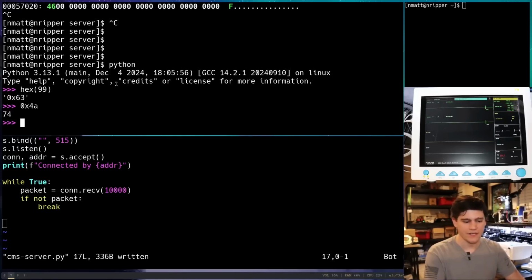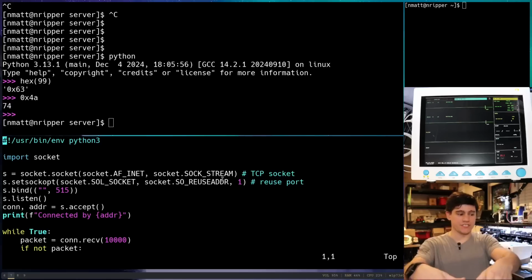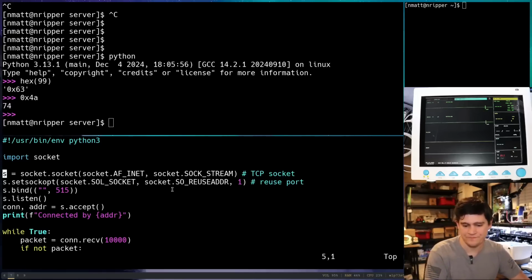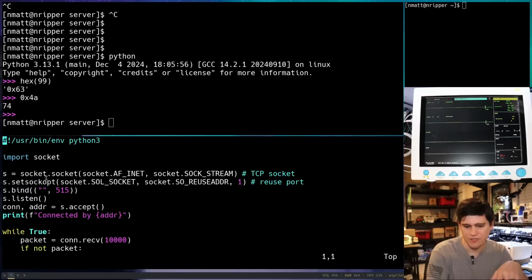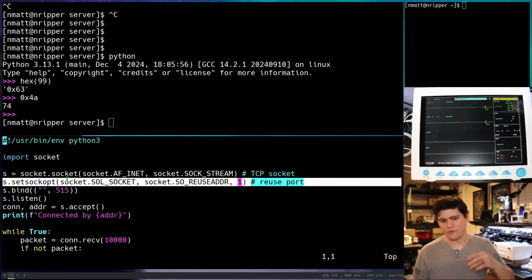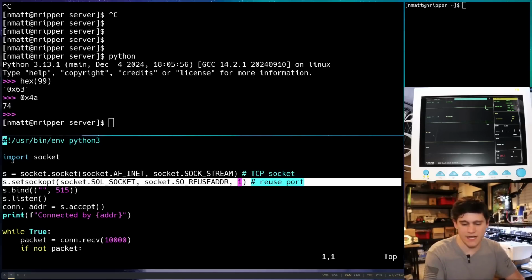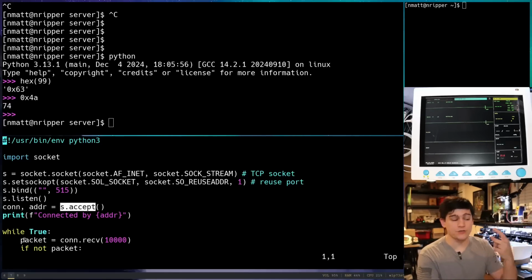So what we're going to do here is code a Python socket server to listen on port 515, and then it's going to receive these data packets and start to parse them. What I have written so far is just very basic Python socket code. We're setting up a TCP socket, and we're setting it so it's not annoyed when we want to constantly kill the program and recreate the socket. We're going to listen on port 515. We call bind, and then we're listening, and then we accept connections. And once we get a connection, it will start to receive packets.